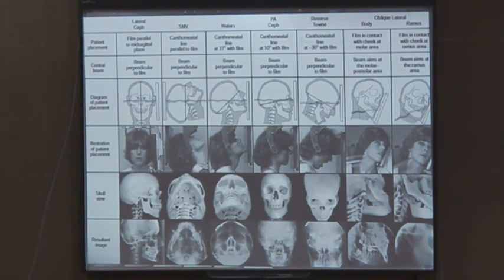If it is oblique lateral of body or ramus, it is to see any impactions, fractures, cysts, tumors, extents, that is it. So the maximum number of questions is only this much in this. You remember this column, you will be fine. Okay.